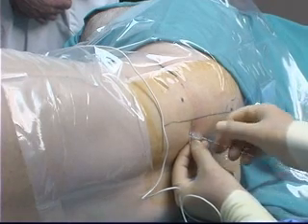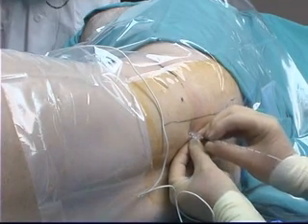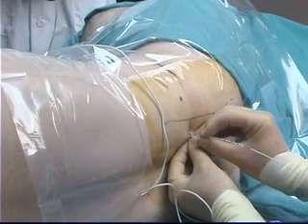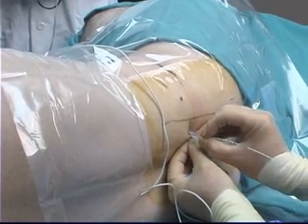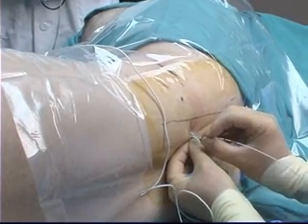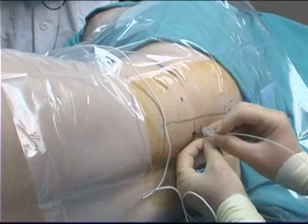The nerve stimulator is now attached to the proximal end of the stimulating catheter, and the catheter tip placed in the needle shaft. Notice the broad black mark on the catheter, which indicates that the tip of the catheter is now situated at the tip of the needle. The catheter is advanced beyond the tip of the needle, and the motor response should remain unchanged during catheter advancement. If, however, the motor response changes or the twitches stop, it simply means that the catheter is advanced away from the nerves, possibly into the psoas muscle or even intra-abdominal.